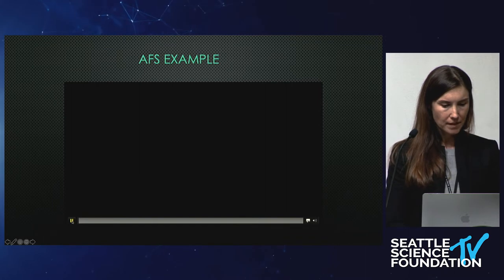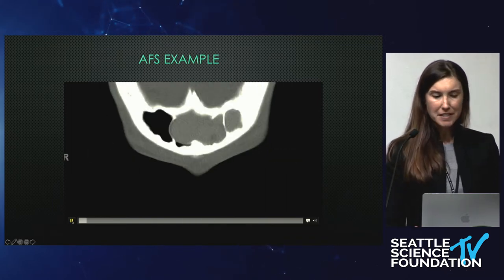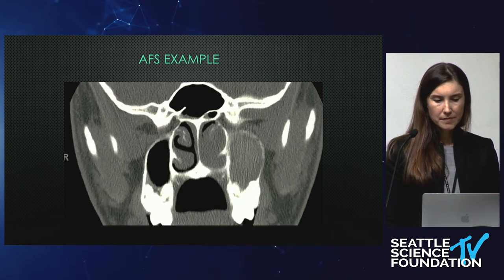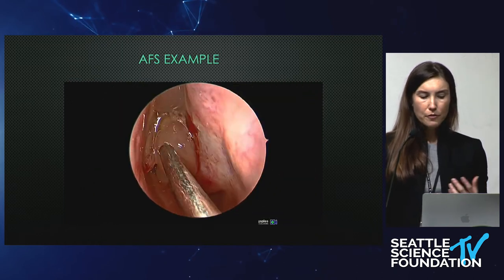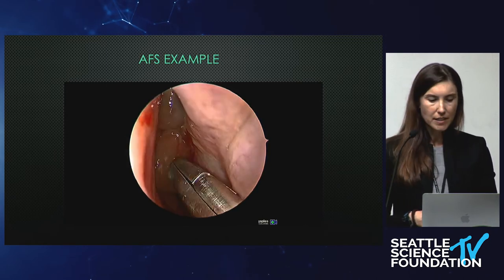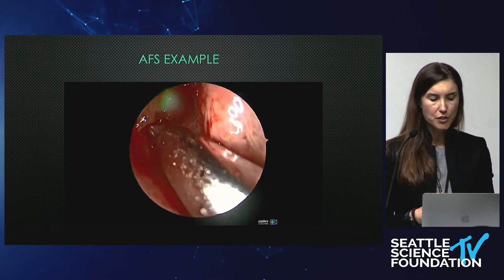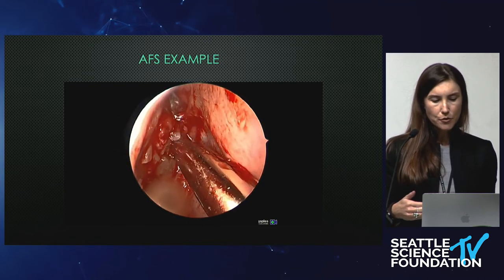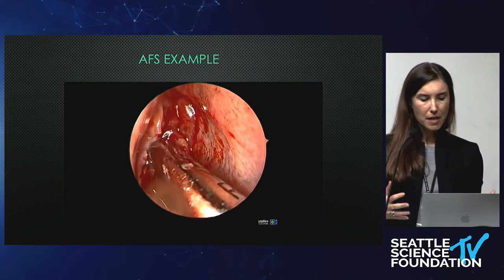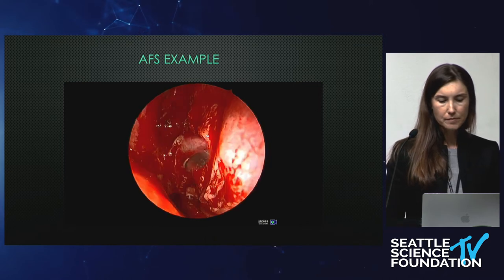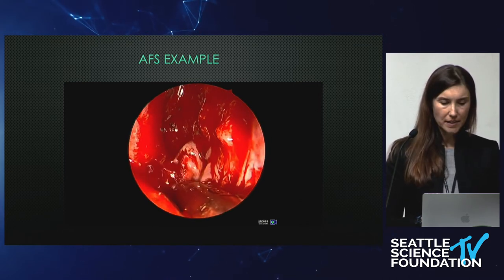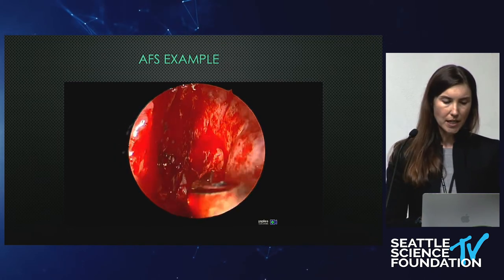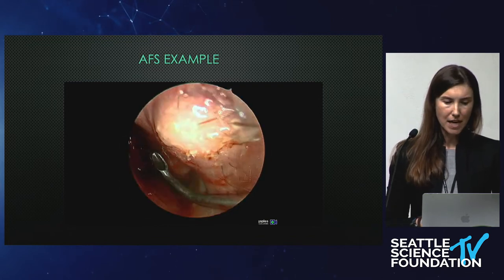This is an allergic fungal sinusitis case. On the CT scan, the brighter areas are the allergic mucin that contain all the minerals. We have a patient with a lot of polyps filling most of the nasal cavity. The first thing is to set that anterior-posterior boundary — removing nasal polyps with forceps or a microdebrider, keeping in view the septum and the inferior turbinate. Here we're starting to define the choana in the back, and now we've set that distance. Then we bring in our curved probe to start entering into the maxillary, at the posterior one-third of the inferior turbinate — this is the posterior fontanelle — pushing down and back.